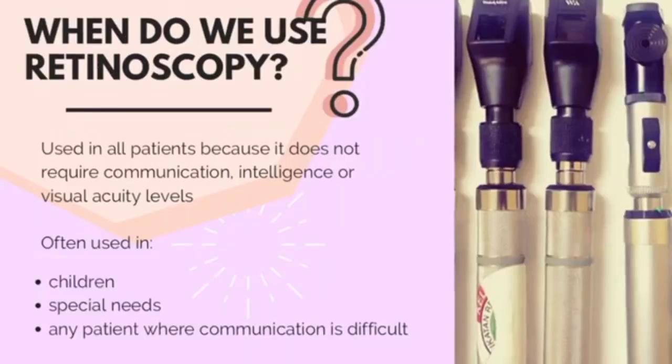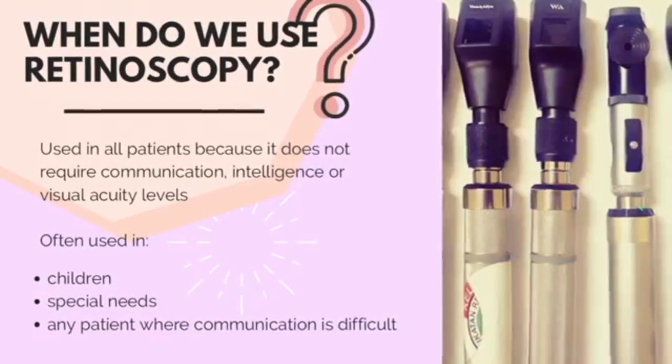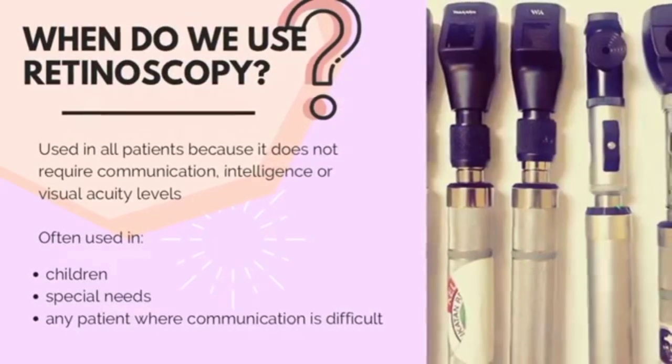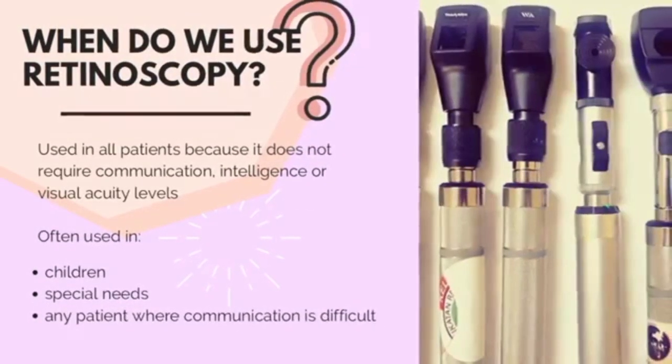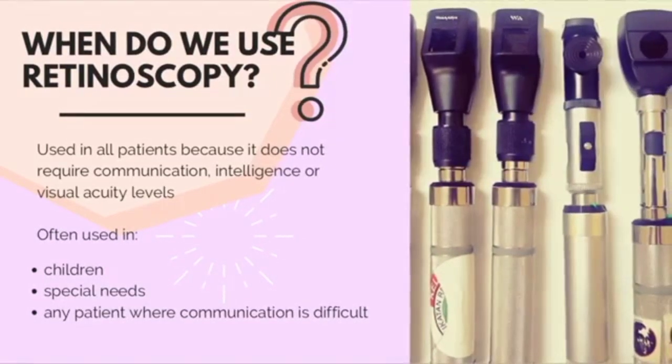So when do we use retinoscopy? Retinoscopy can be used in all patients because the test does not require any communication, intelligence, or visual acuity levels. It is often used in children, special needs, or any patient where communication is difficult.